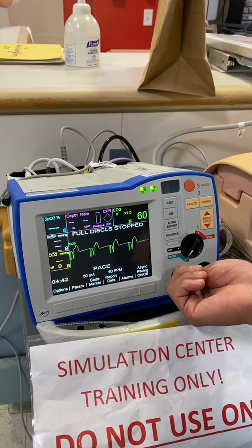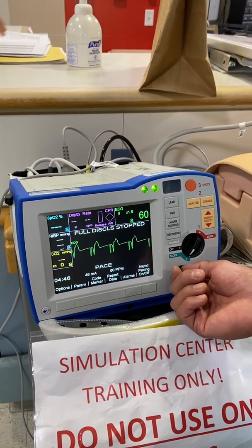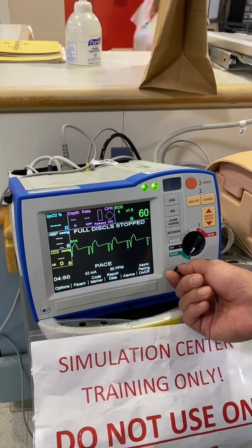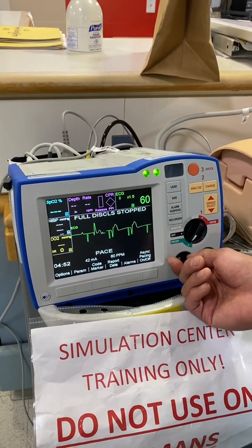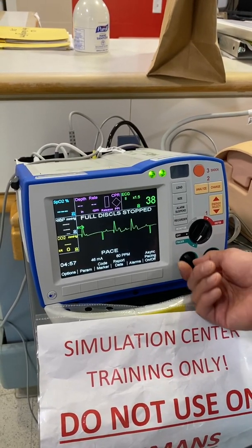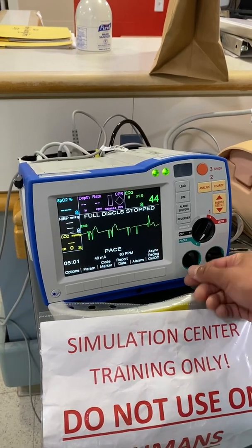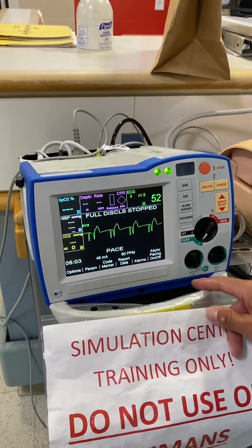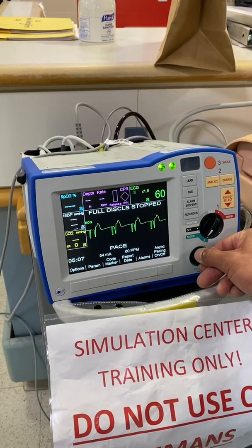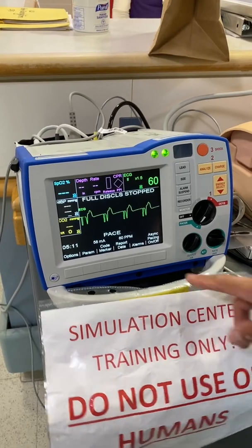So I'm going to go down a little bit, nice and slow, and see when my pacemaker stops capturing. Right around maybe 40 to 48 — so 48 is my threshold. To be safe and ensure I have capture, I'm going to go up 10 to 58. All right, so that's pacing.